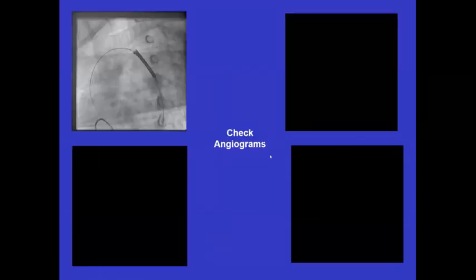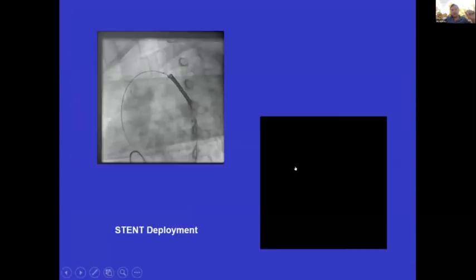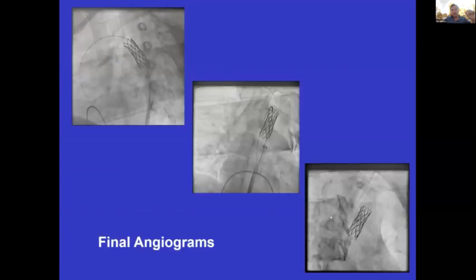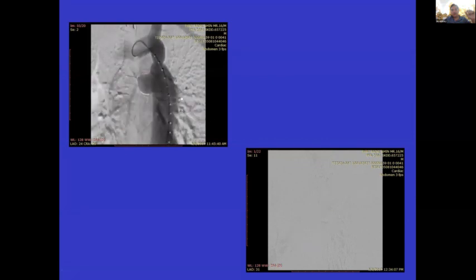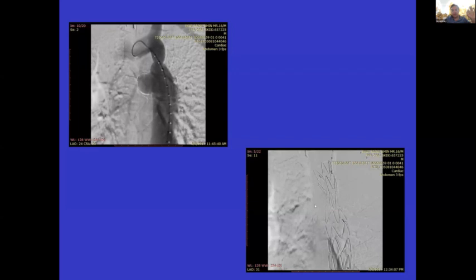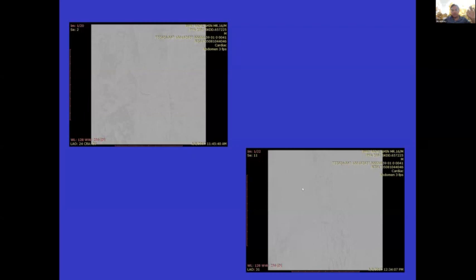Okay, so I'll complete my case. I just deployed this stent, and it is the usual course where I tried a covered stent in the final angiogram. Of course, this was the last case. It's important to see the adjacent structures. There you see a 10-year-old child with an adjacent aneurysm. This was the CT scan which was shown initially, and we had to cut down and place a stent graft to cover it, and subsequently balloon dilate our graft for the final result.